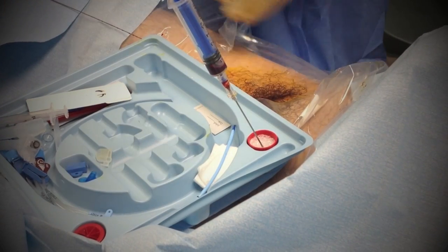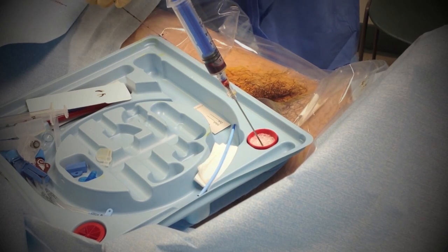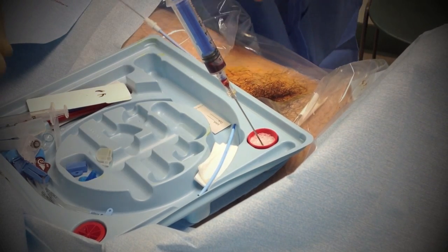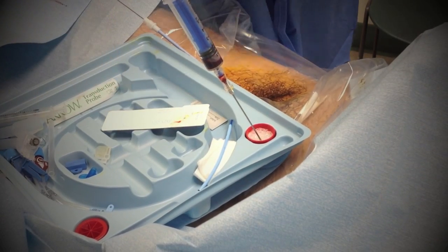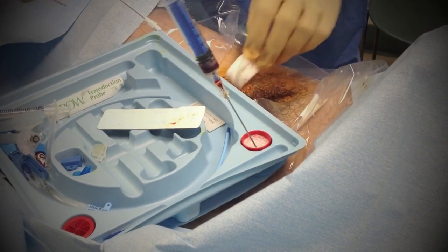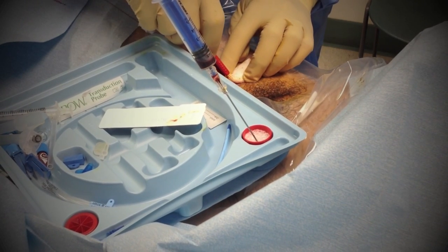Next thing is to dilate the vein. I'm going to use this dilator. But the dilator is pretty thick, so we need to do a nick in the skin so it can go in.